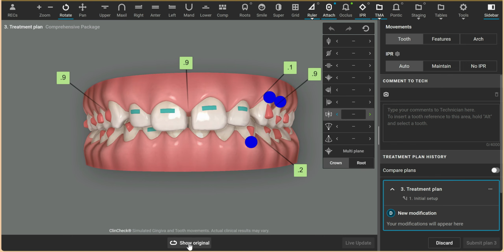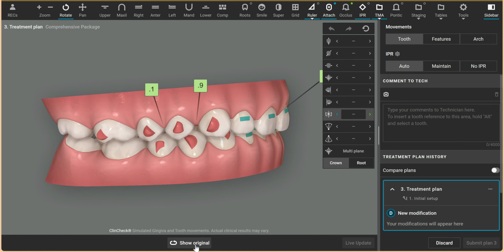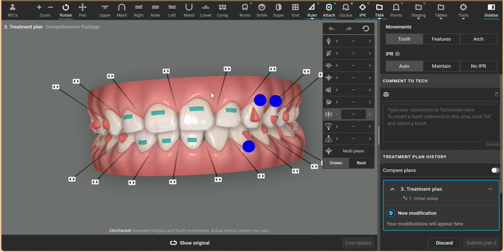I want to show you a case that's a little bit tricky. Here's the original. It's a spacing case, it's a deep bite case, and it's a case where there's lingual inclination of the upper incisor teeth. And the treatment plan here, the goal is to close all spaces.